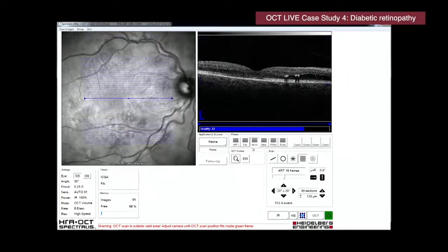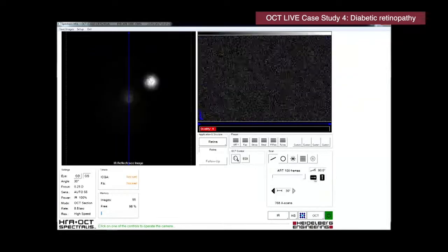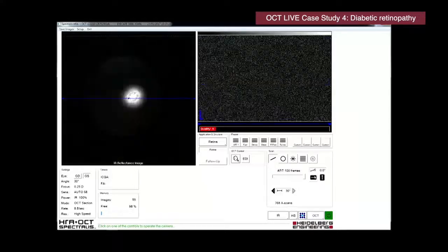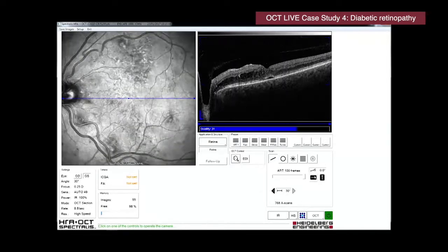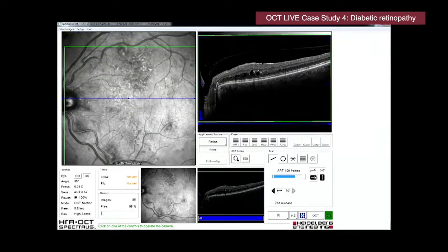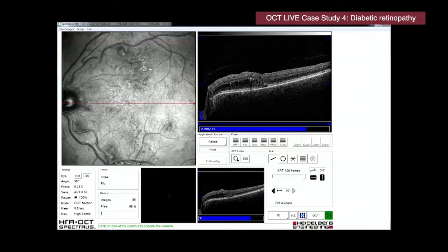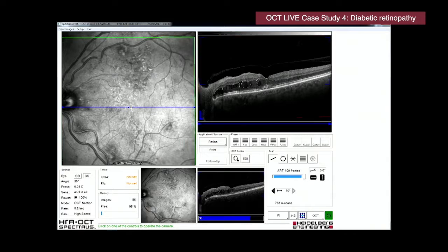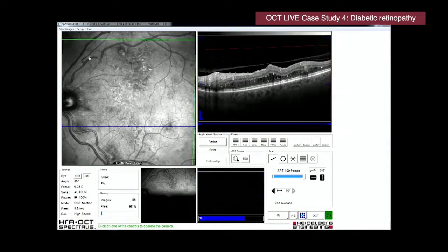Okay. I'll look at the other eye then, Phil. Let's just go through this area just at about 4 o'clock, which there. And again, superiorly, this area here.